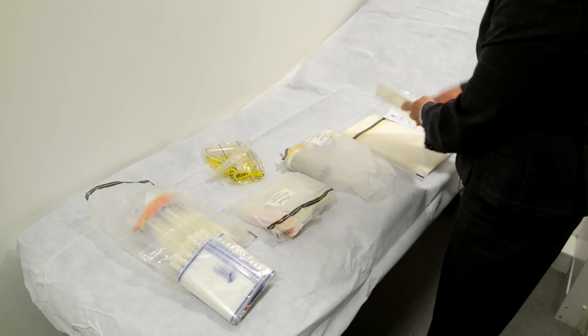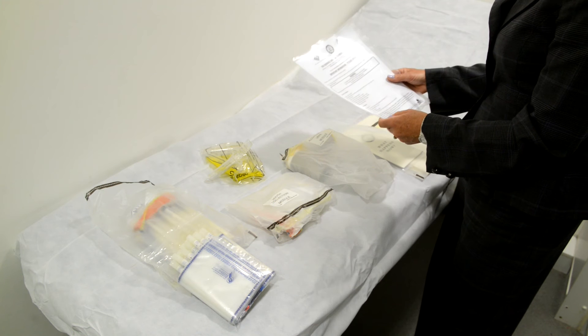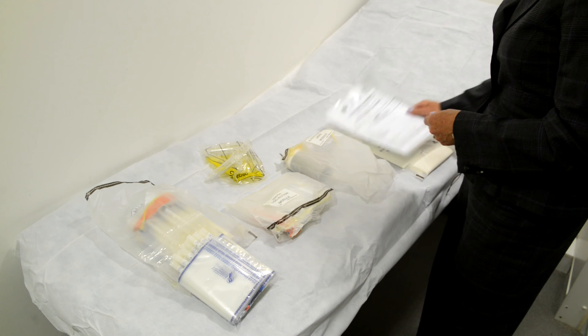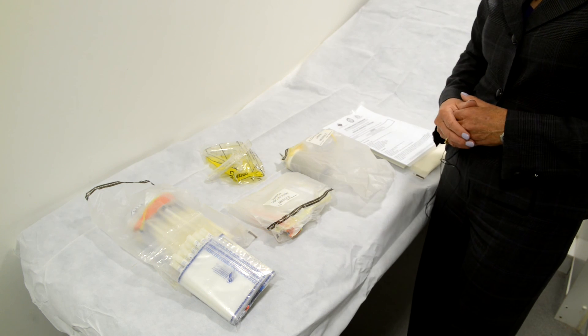There's a lot of literature about what happens now, and the forensic medical examination forms that have to be completed by the forensic medical examiner or the nurse practitioner. And that's really it, but I wanted to show you some of the kit.